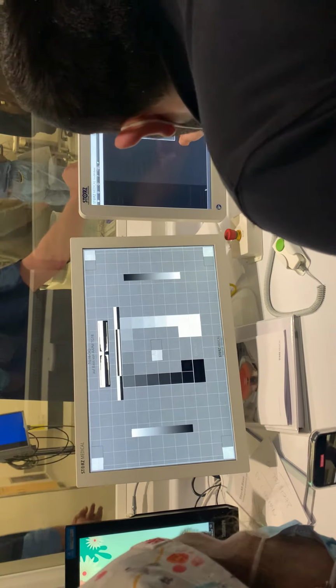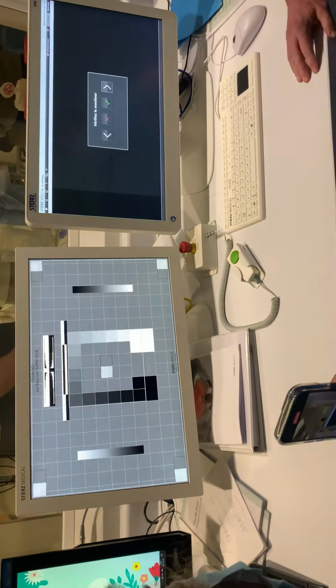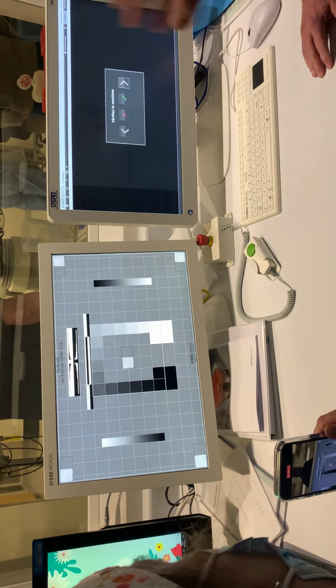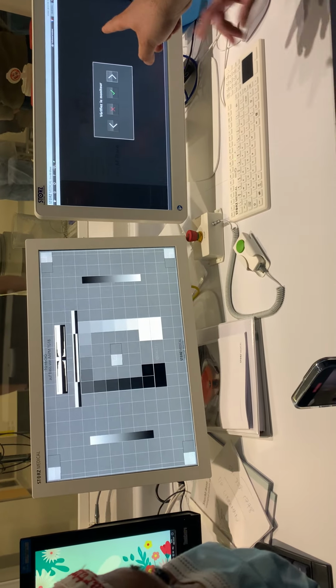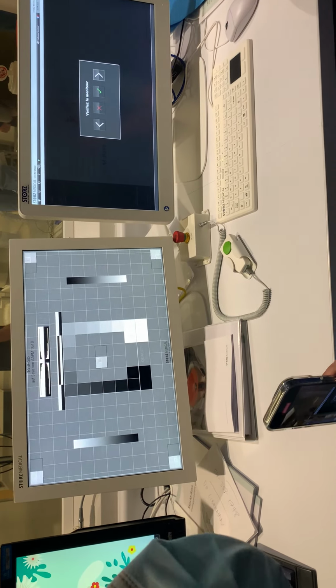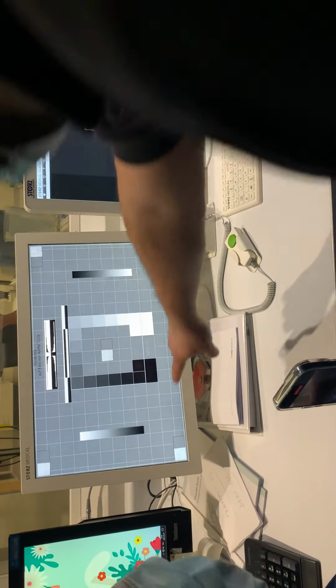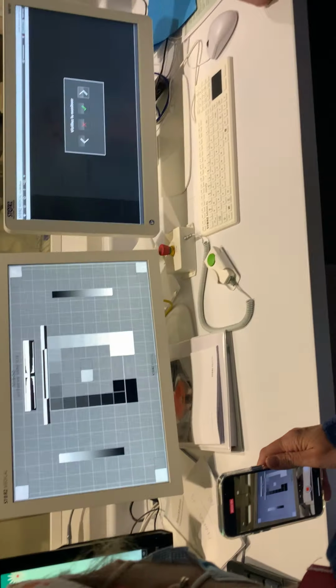You can also switch to all of these patterns here with the clicks, but most of the time you will have one look. If it is fine, you will press it is okay. If you press X, you can still make your treatment, but you will get a message: this monitor is not suitable for diagnostics.